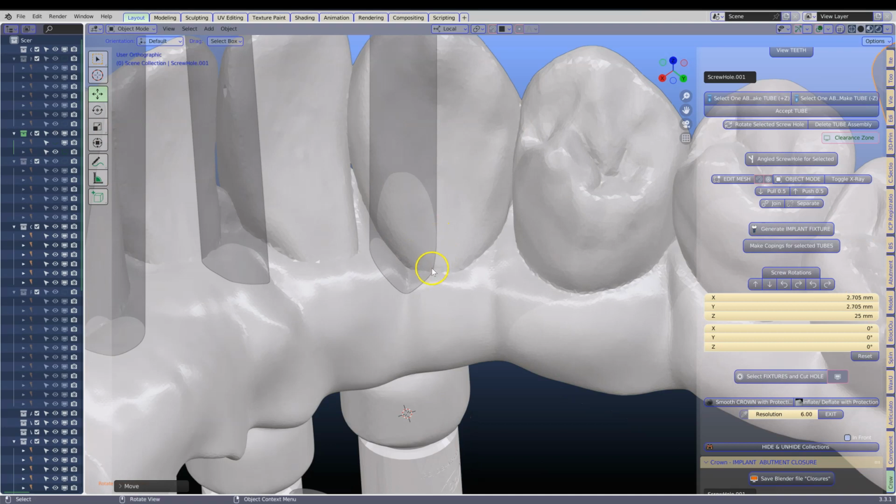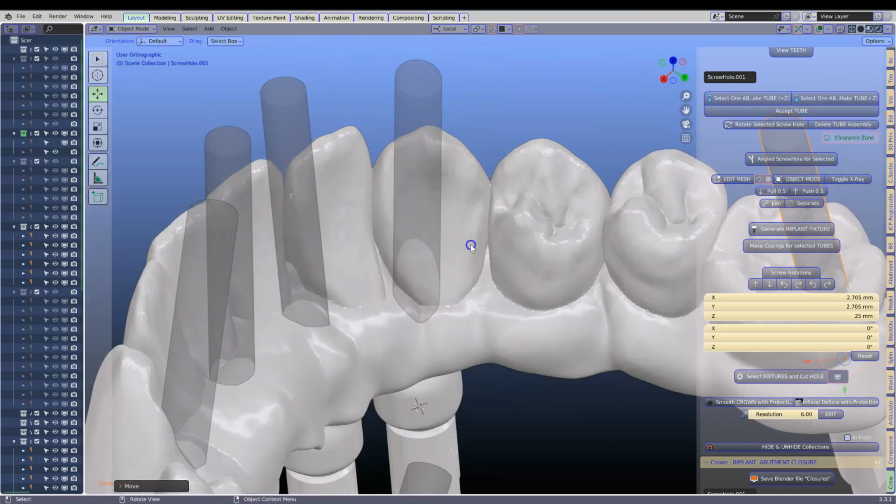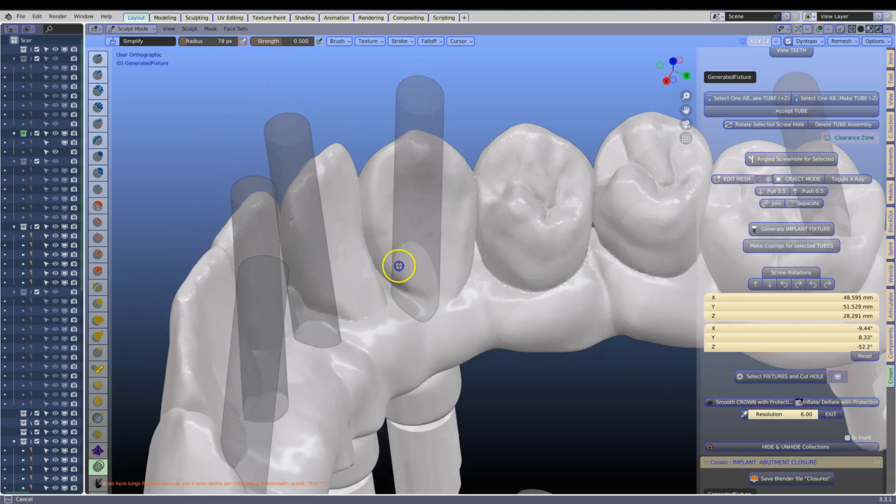through. So here we can see a kink, and we can see a kink over there. Let's change that. Let's smooth that down a little bit, because the nicer the exit, the better the geometry is going to be. So here I'll just smooth to make sure we can actually get a nice hole going through there.